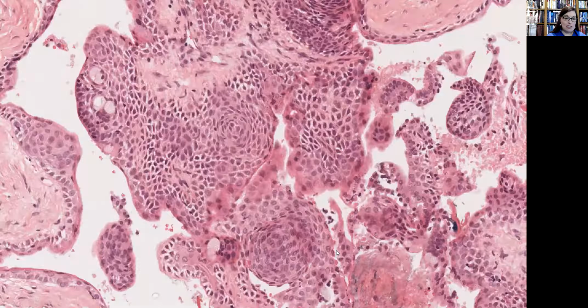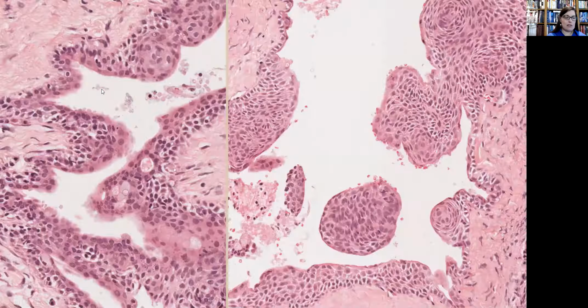You can even start to see these areas that we would refer to as whorls. You can see, again, whorls. You can see mucus cells. You can start to say that maybe these are papillary-type projections. We can see clear cells that are more at the basilar-type layer. You could see eosinophilic hobnailing, duct-like structures.